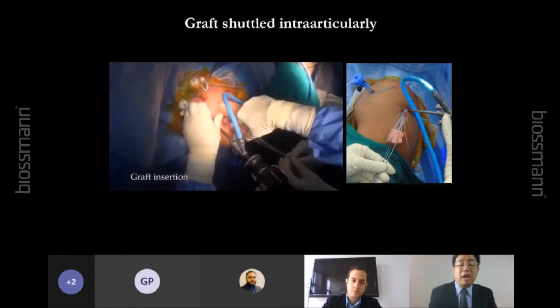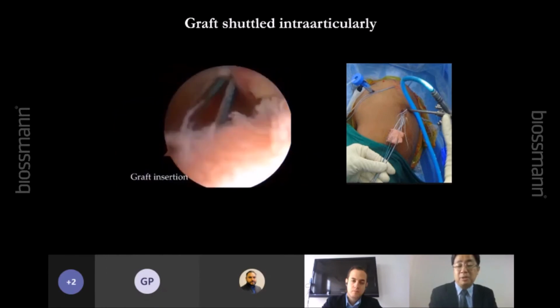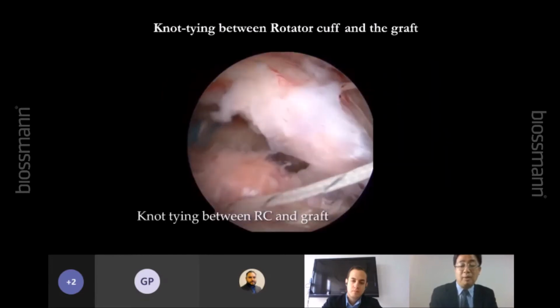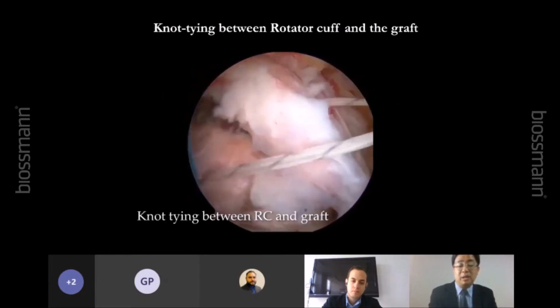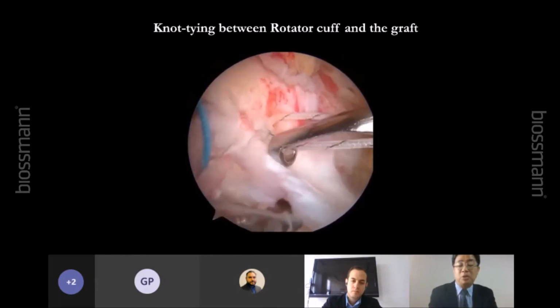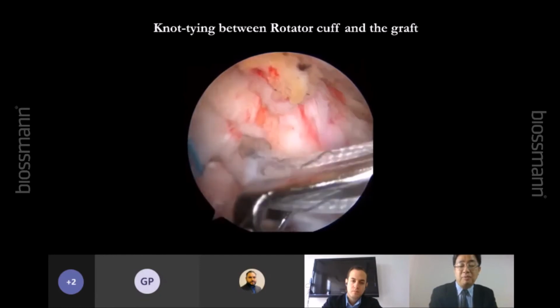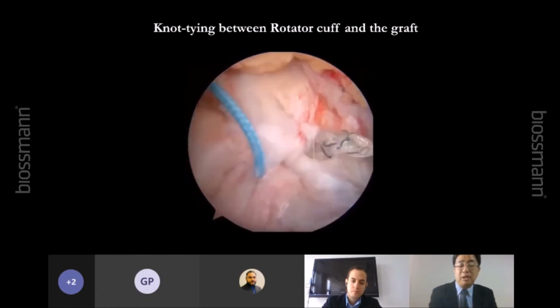The size of the graft, the thickness, is very important. It should be at least 8 millimeters. And for Thai people, the width is around 4. And then we make a side to side. We repair the graft to the left of the cuff, and also we repair to the glenoid side.